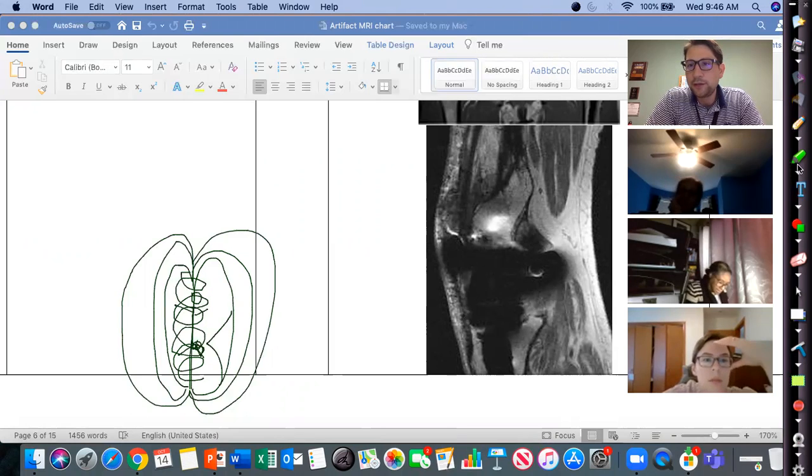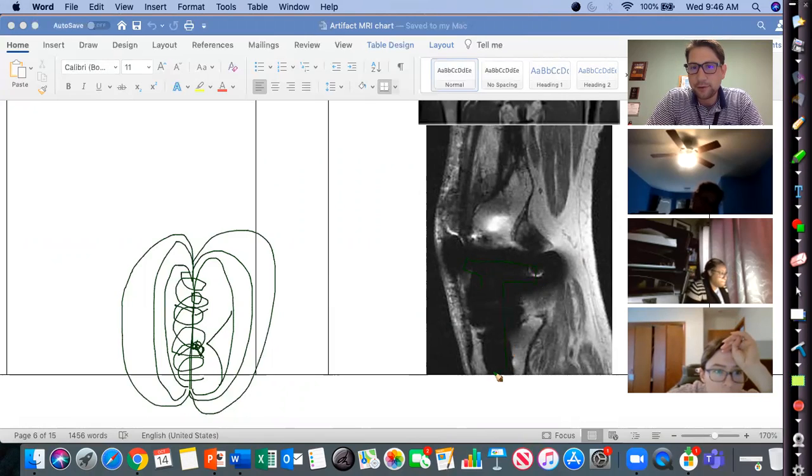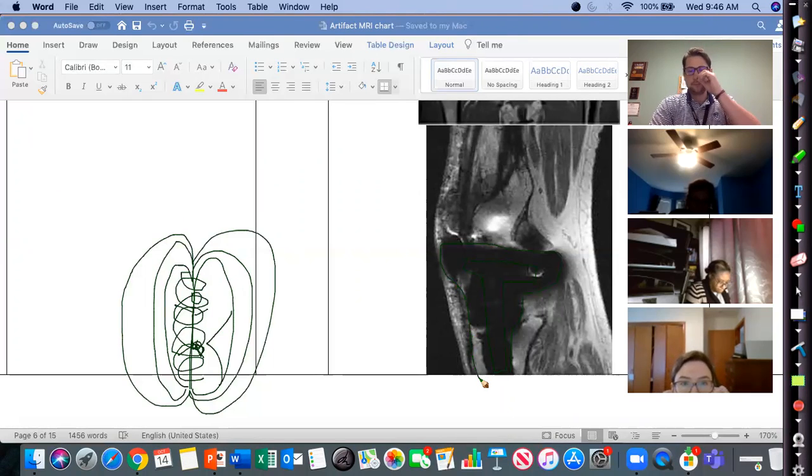Right here, we know from x-raying many, many knee replacements that typically a knee replacement has this very straight edge, and then a metal part that goes down in the knee. So we get signal loss because of the metal due to dephasing, but then we get this added distortion area because it's changing our magnetic flux lines. Because that metal is attracting those magnetic flux lines.